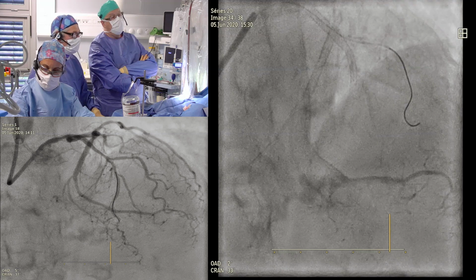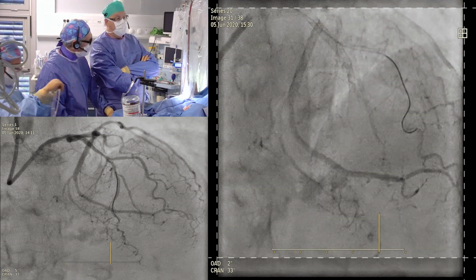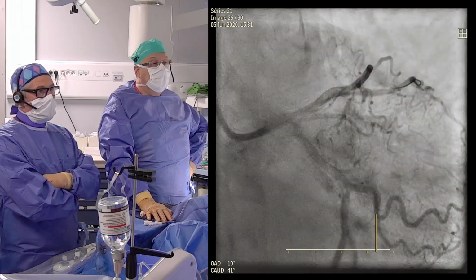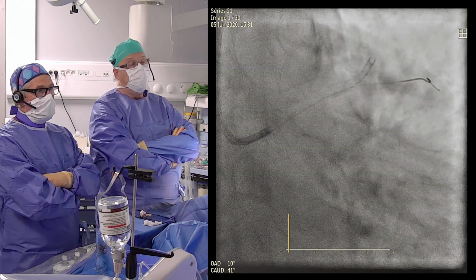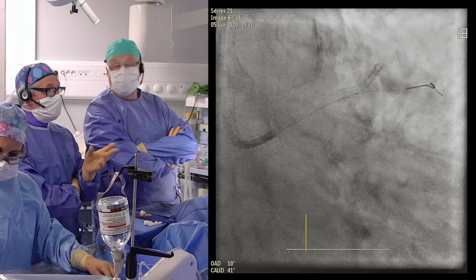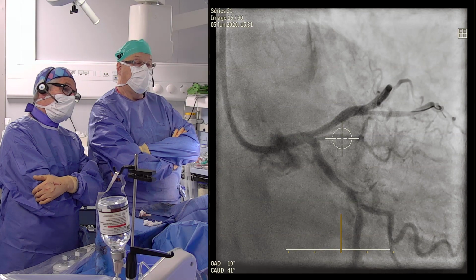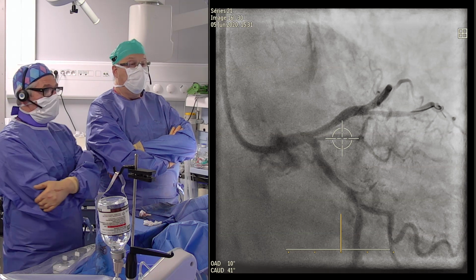So you see in this view, we have something very nice. Maybe we can do another one. I suggest to check the PA caudal we did. Yeah, absolutely. I think it's a very nice result. We have already done a good POT up to the proximal part of the stent. Yeah, we did 2 POTs distally. Now the kissing was done with a very nice result in both branches. Yeah, so I think it's good.